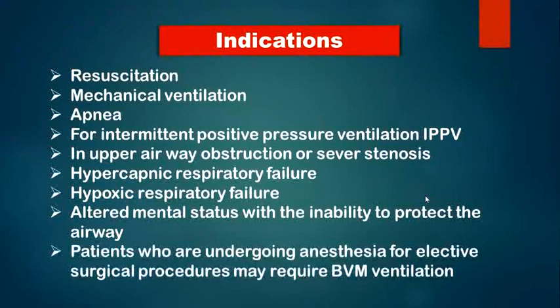Or patients who are undergoing anesthesia for an elective surgical procedure may require BVM ventilation, but this is, of course, the other type of Ambu bag, which needs re-inflation, not like the self-inflating one used in emergency situations. Now, what are the contraindications of using a BV mask?